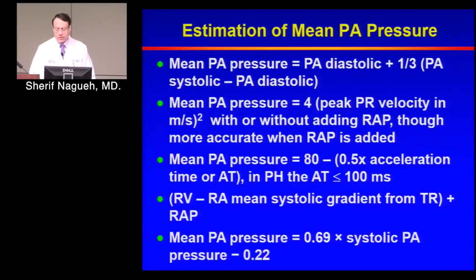The problem with this approach is people have said it's not necessarily linear. It could be logarithmic. People have also said that these time intervals depend a lot on the RR interval and the presence of conduction disturbances and so on, so it's not always accurate. But more recently, there has been some revitalization of this approach.